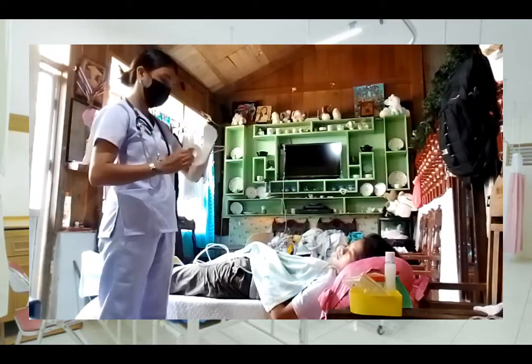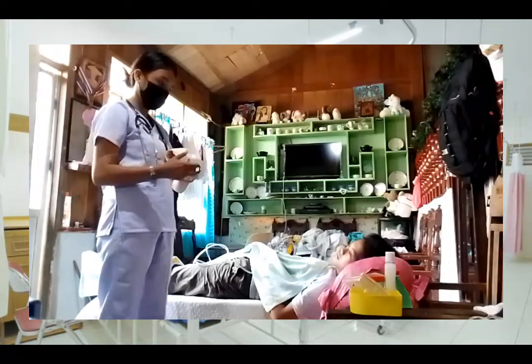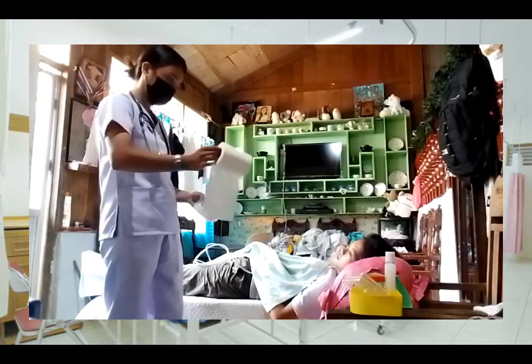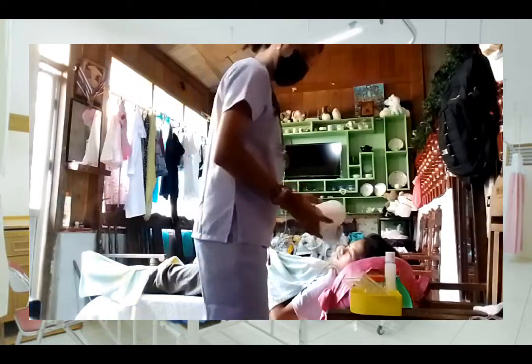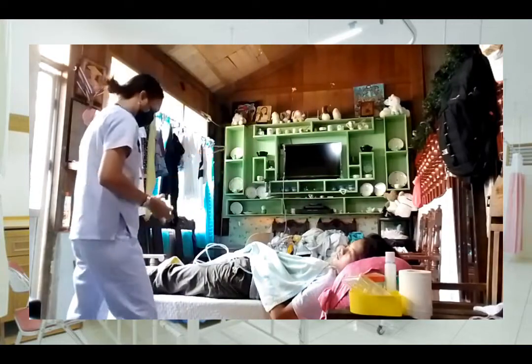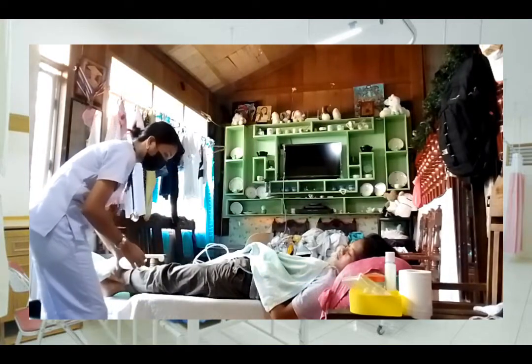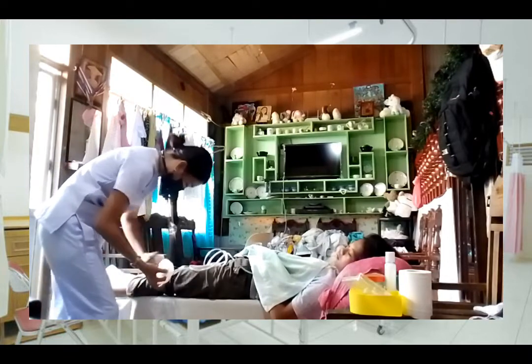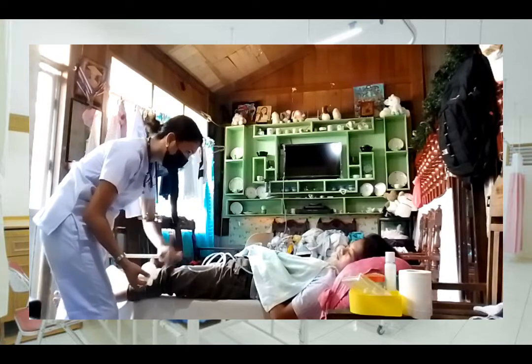Evaluation: appearance of the urine in the bag and the specimen obtained. Also evaluate the condition of the urinary catheter. Documentation: record the procedure on the flow sheet, record the method used to obtain the specimen, record the appearance of urine, and record the time the specimen was sent to the lab and received by the lab technician.